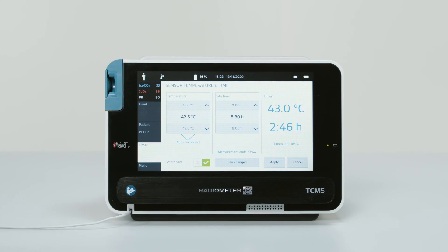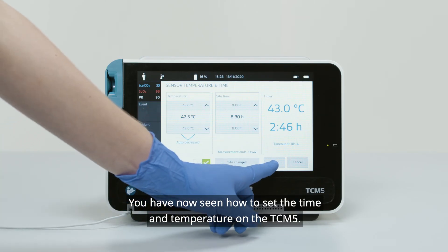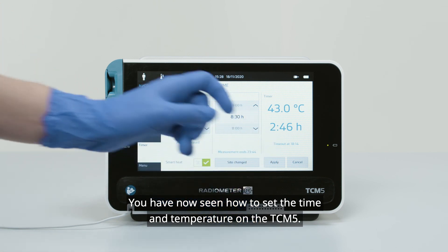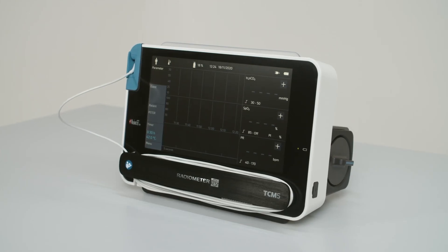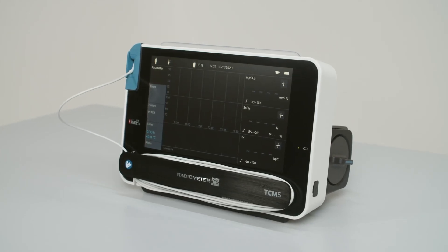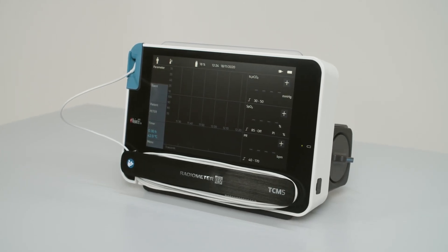When changing any item within the tab, please press Apply to confirm the settings. You have now seen how to set the time and temperature on the TCM5.